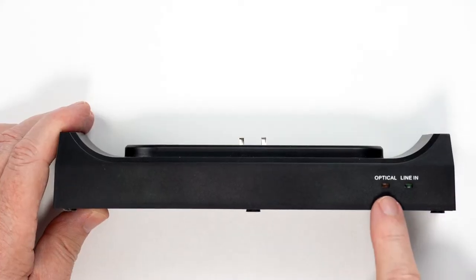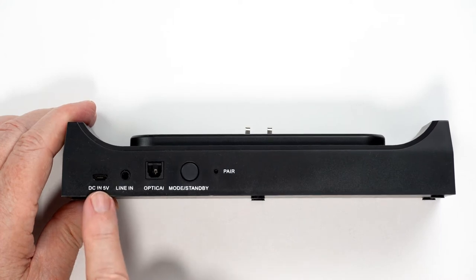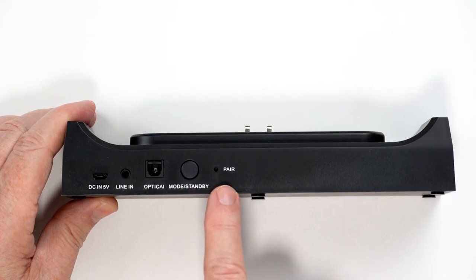On the front of the dock is the optical and line-in indicators. On the back is the power connection, 3.5mm connection, optical connection, mode or standby button, and pairing reset.